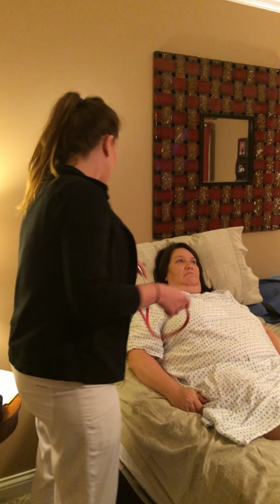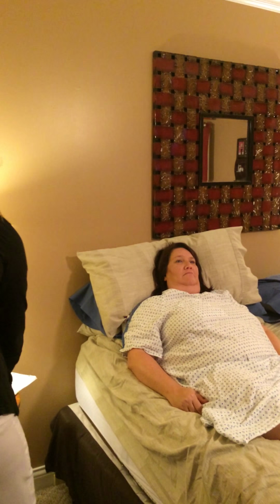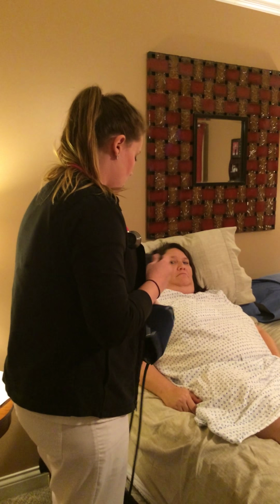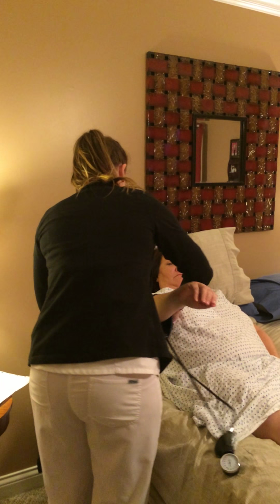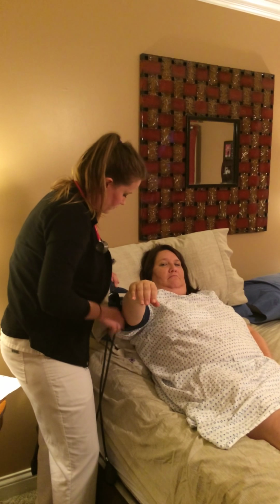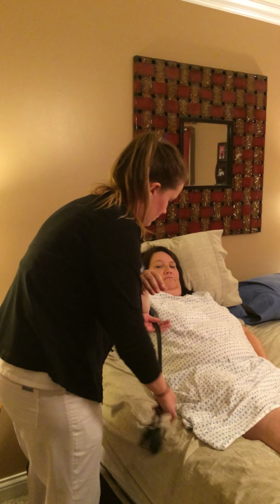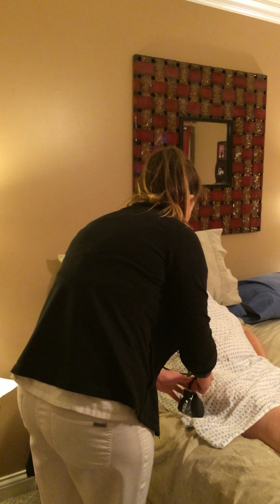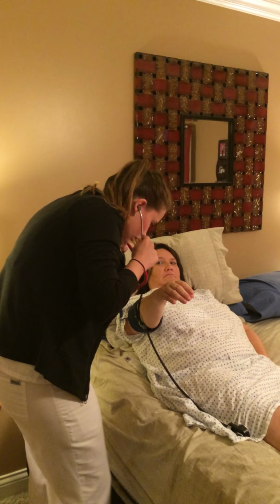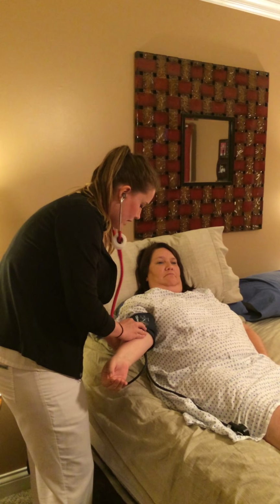Okay. So the first thing we're going to do is take the blood pressure. And we want to make sure that we have an appropriate size cuff. Just going to put this on the patient's arm. Going to have our arm midline to the chest to get an accurate reading.